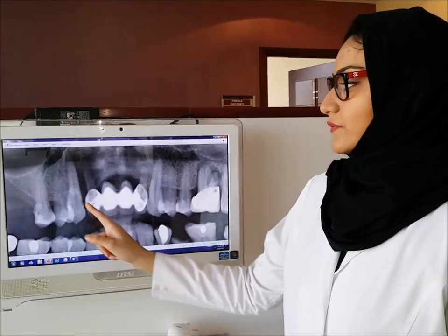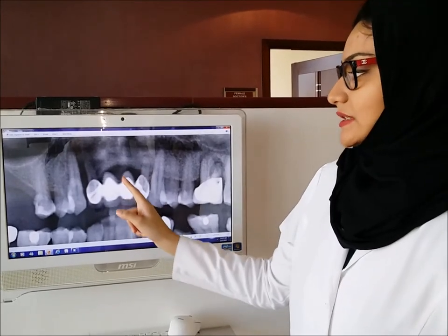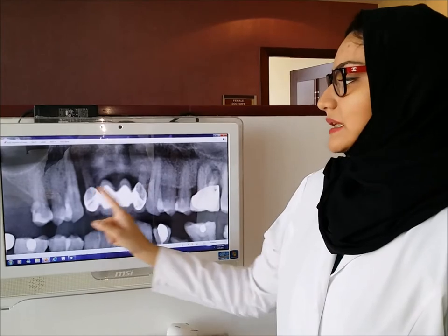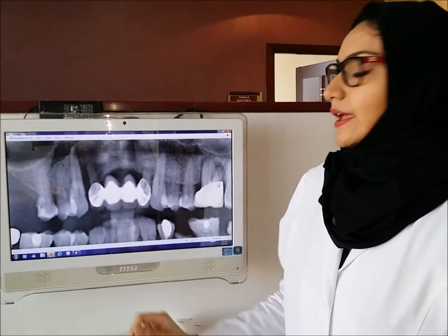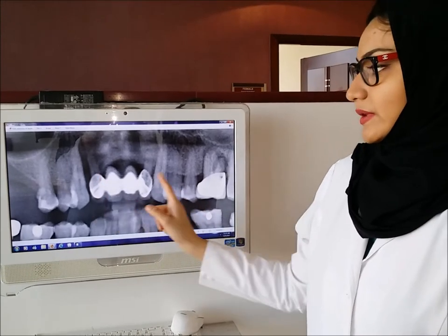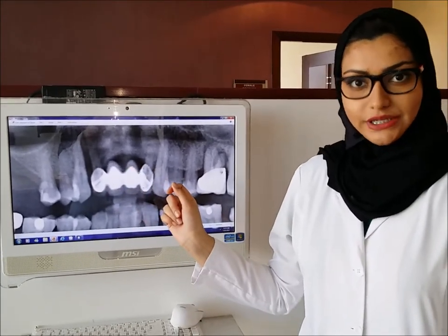Patients get dental bridge treatment done without properly knowing how to take care of the bridge. With good care, the dental bridge can last up to 10 years or more. Here we can see a 4-unit anterior bridge where the central incisors are the false teeth and the abutments are the lateral incisors. We can see bone loss around the natural teeth because the patient did not know how to take care of the bridge.